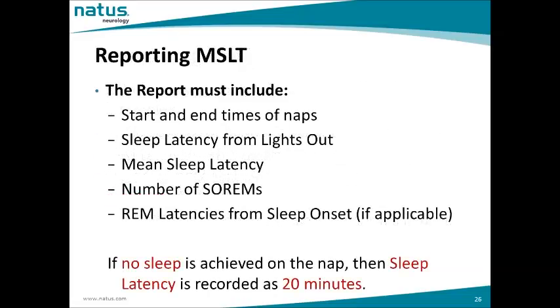Okay, how do we report MSLT? The report must include the start and end times of each of the naps, sleep latency from lights out or lights off, mean sleep latency, number of SOREMs, REM latencies from sleep onset if applicable. If there's no sleep achieved on the nap, then sleep latency is recorded as 20 minutes.